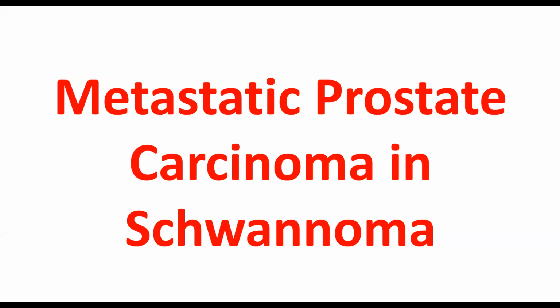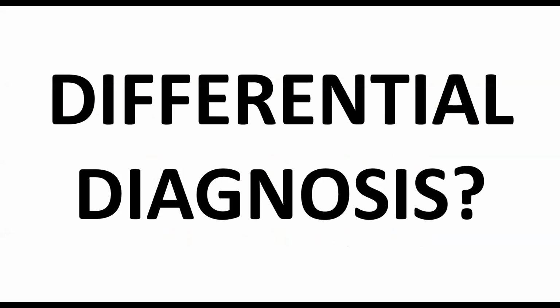That is thoroughness. You like that? Oh, it's magnificent. Okay, what's your differential diagnosis? Now, do you even understand that question? I thought we just arrived at the diagnosis. We have prostate carcinoma in schwannoma. There is always a differential diagnosis. I can think of 3 possibilities to explain prostate carcinoma in schwannoma. Number 1, floater.